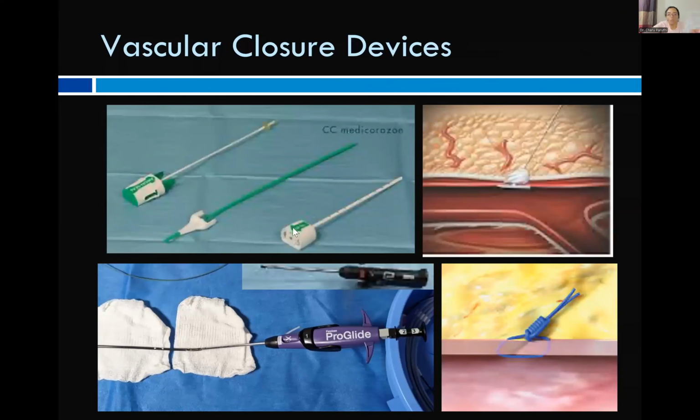So then also we have something known as vascular closure devices. Usually when the procedure is over, we take out all the instruments and then we take out the vascular sheath. Now we've created a hole in the vessel wall and we want to seal that hole. So that is usually done by manual compression. But sometimes we've used a very big size sheath, like an 8 or 9 French sheath, or the patient is on anticoagulation, as when you're putting in a stent, the patient is put on anticoagulation. So you know that he's going to bleed a lot, and manual compression either will take a very long time or might not be sufficient. So that's when we use these vascular closure devices.